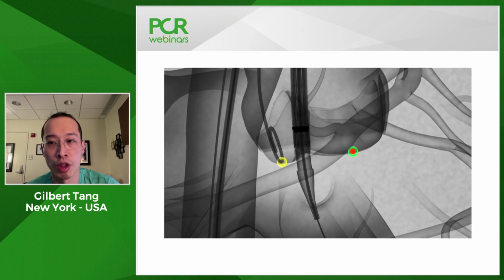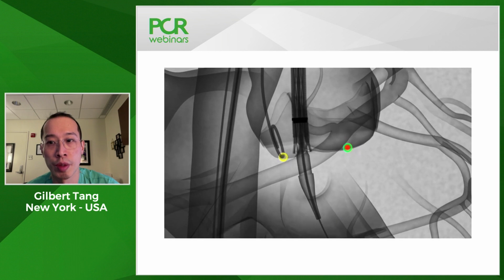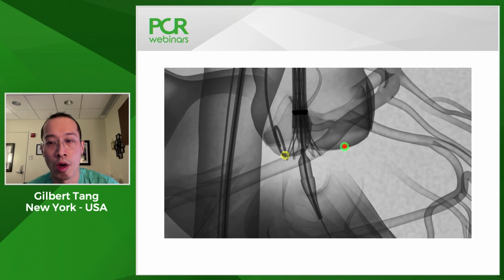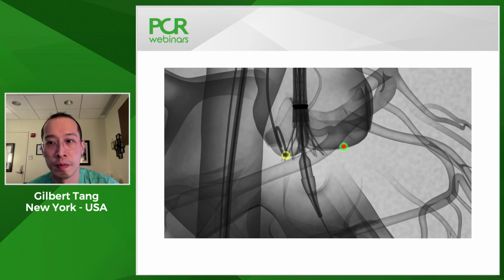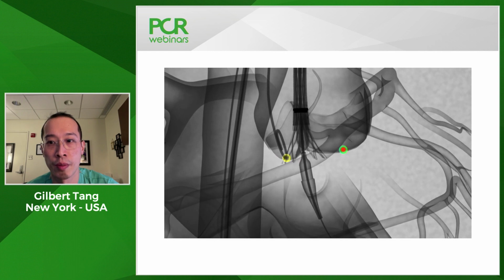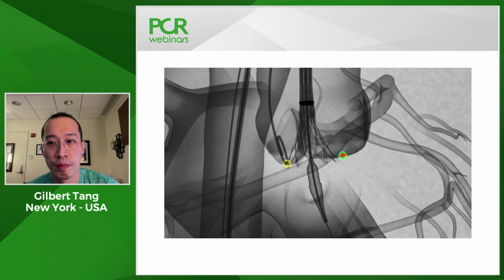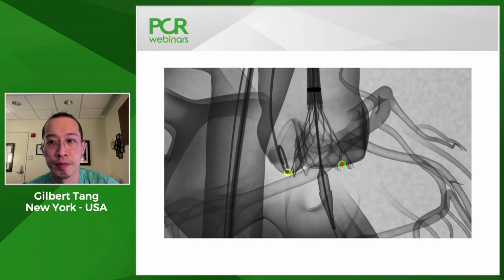Of course, it depends on what the septal length is and where the conduction system is located. And as you deploy, you can see that at the 80% mark, you should have pretty good commissure alignment. So you can see here, this is the control pacing part of the Evolut delivery deployment. You have annular contact, and then you go quickly to 80%.